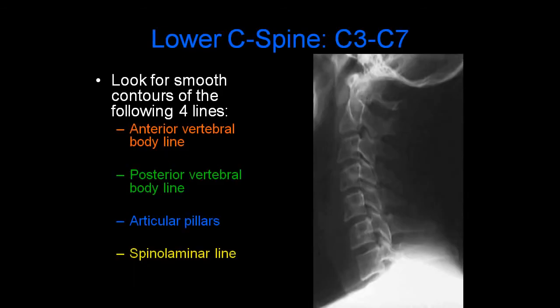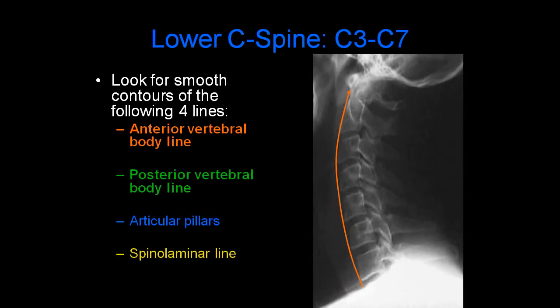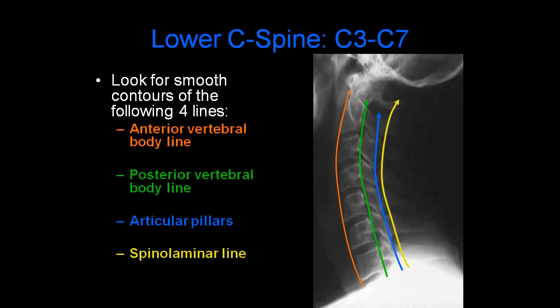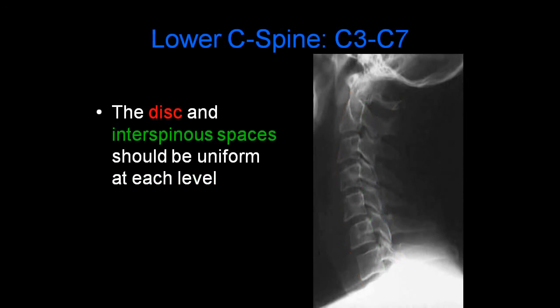When looking at the lower cervical spine, it's important to look for smooth contours of the following four lines: the anterior vertebral body line, the posterior vertebral body line, the articular pillars, and the spinal laminar line. In addition, the disc and interspinous spaces should be uniform at each level.